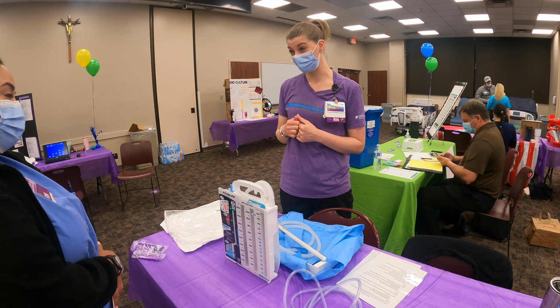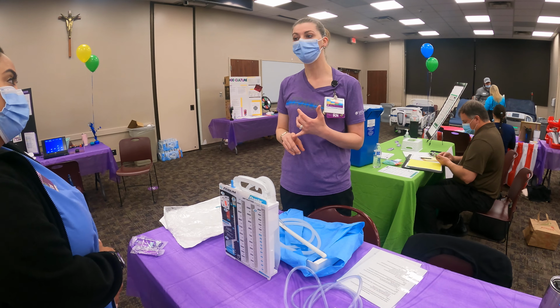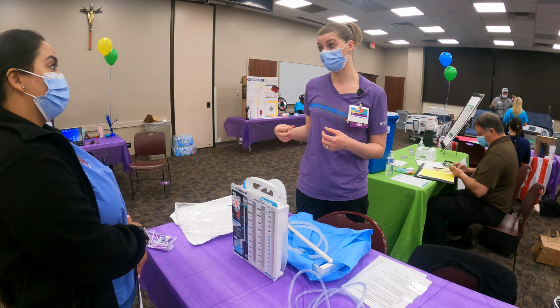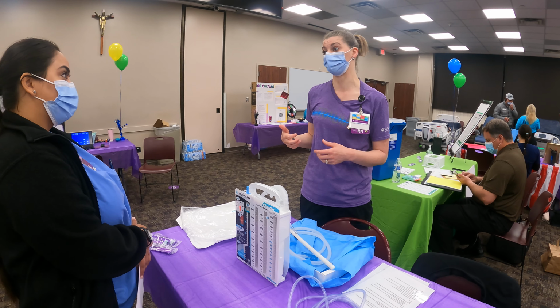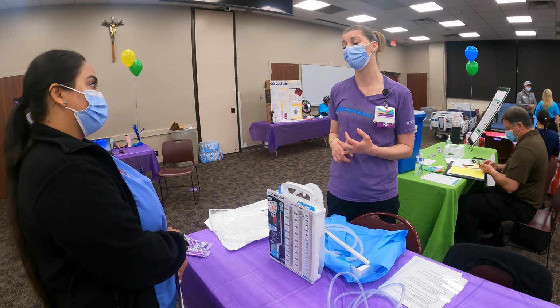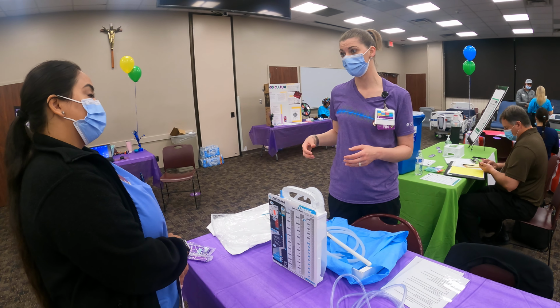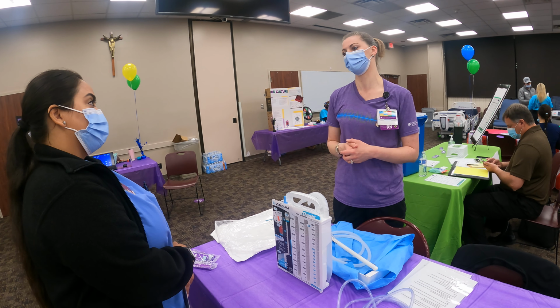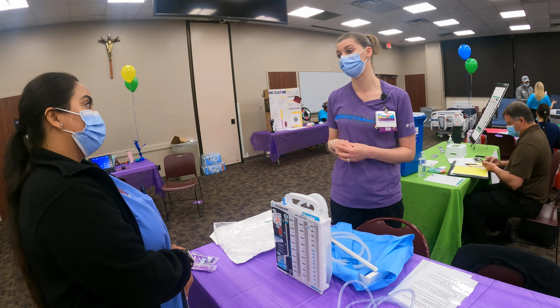When you do change the dressing for trauma purposes, we don't use Xeroform or Vaseline gauze because it's a vector for bacteria and can cause an infection, so we don't use those. The only time that we will use Xeroform or Vaseline gauze for a chest tube is if we're worried about a leak somewhere, and then usually our surgeon has placed that on the dressing.